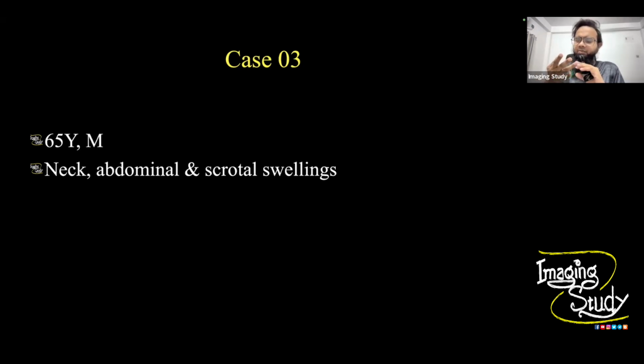So 3 ultrasounds. I asked the patient, what is your problem? Because he came with only the investigation slip where the 3 ultrasound names were written. That's all. No history, nothing. He didn't bring the whole papers, and that is quite common in my country. I don't know about others, but it's very common. I would usually prefer to send the patient back to come again with all the papers, but this patient came from a far distance from my center, and I think he actually needs some evaluation here.